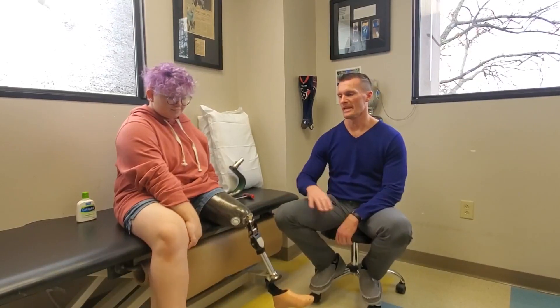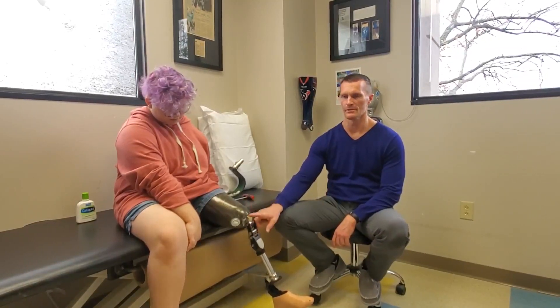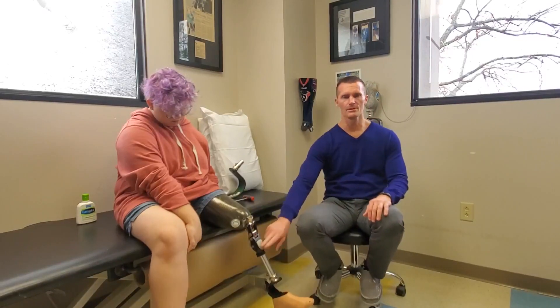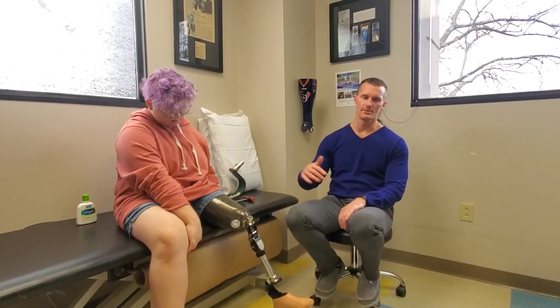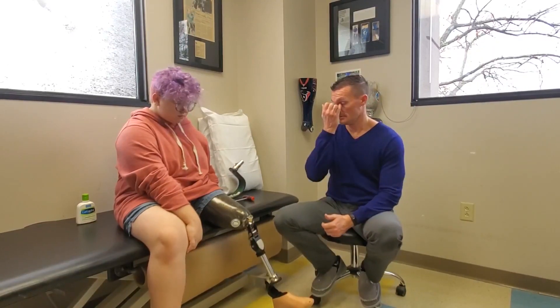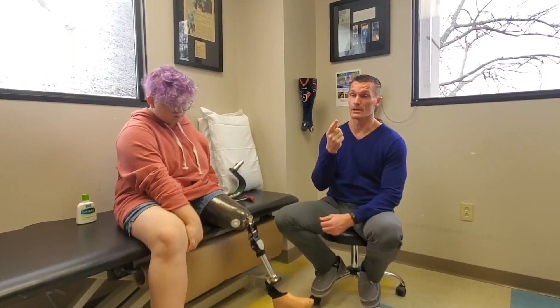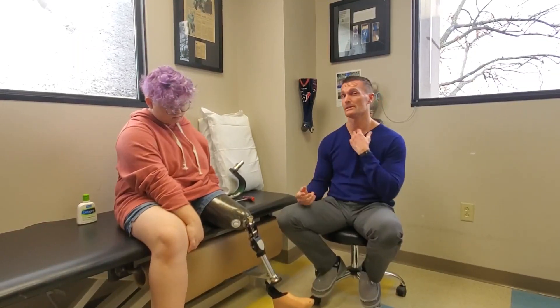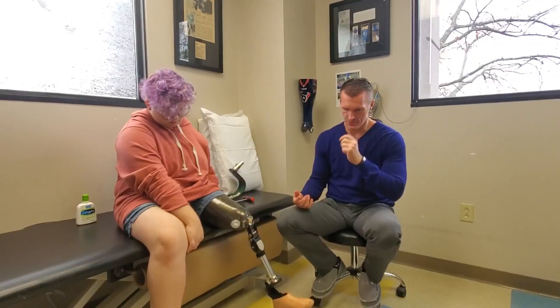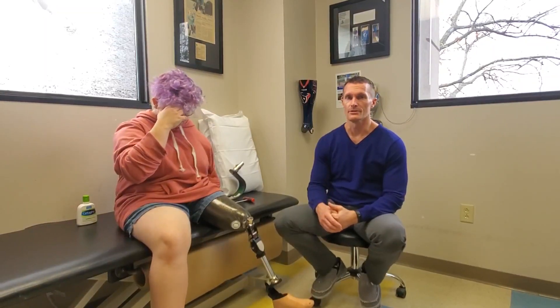Now that it makes sense to use a heavier knee, we are big fans with Andes articulations of using Ossur Total Knees. This is a 1900 friction knee, but we ordered a hydraulic knee that should be here tomorrow — and that makes that problem much better. So when adolescence comes, being able to use adult components with hydraulics is worth the weight at that point. And also having a walking foot is more of a concern.